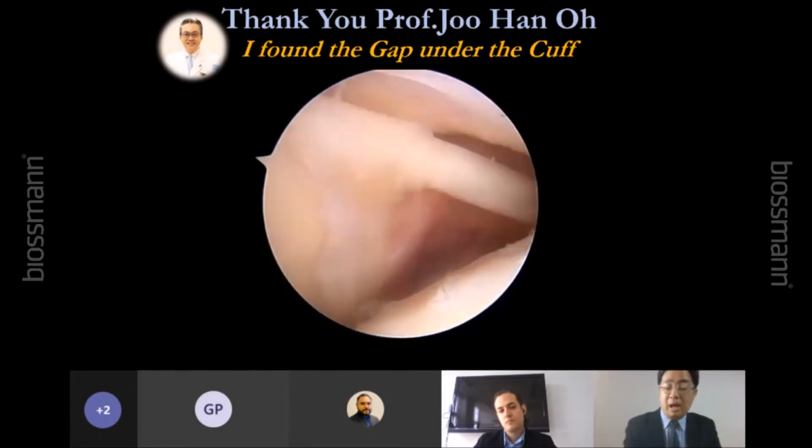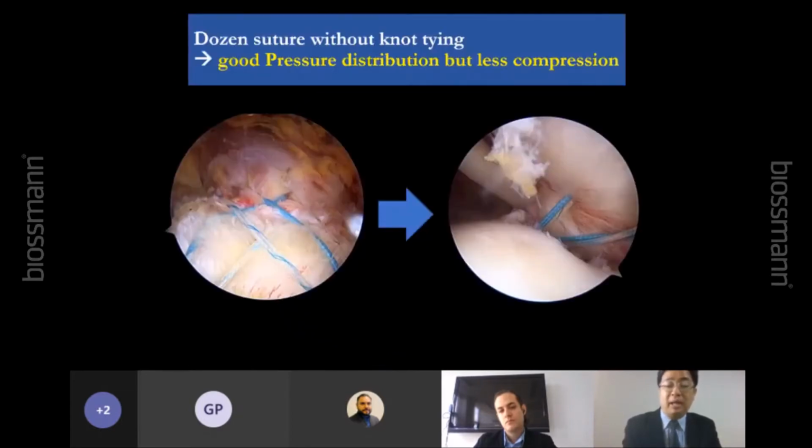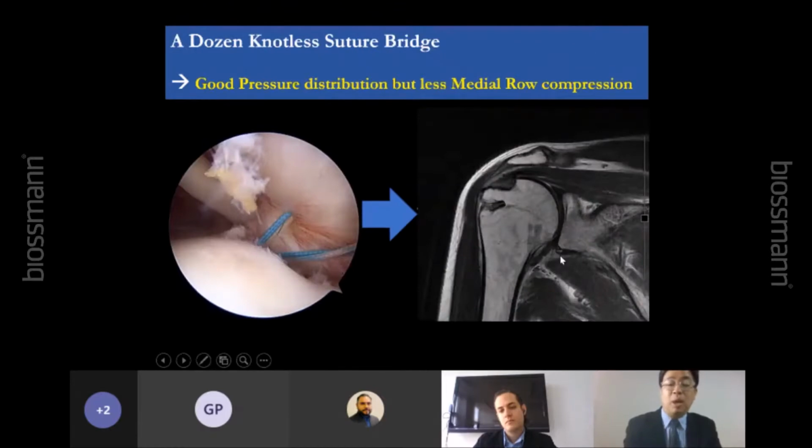After that, I thought over again, what should I do? Outside looks nice, but inside there is still a gap when you didn't tie the knot. But anyway, when I do the MRI study, we found that this patient healed nicely, but I'm not sure that the healing inside is good enough. Is it like scar healing or not, right? Because there's a gap underneath the rotator cuff.